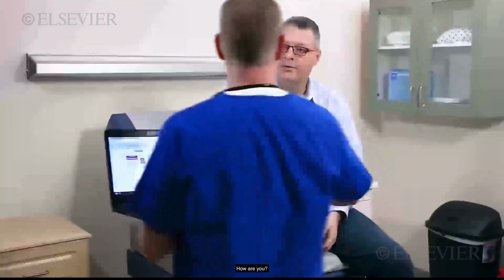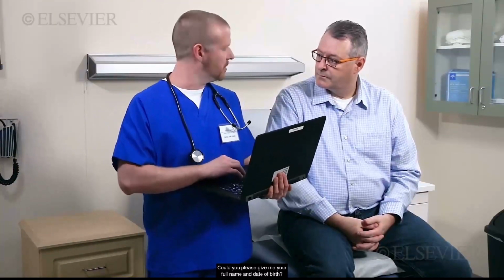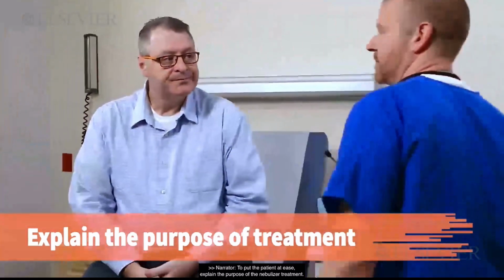How are you today? I'm good. How are you? I'm David. I am Dr. Jones's medical assistant. I'm just going to be working with you today. Could you please give me your full name and date of birth? Kevin Heron. To put the patient at ease, explain the purpose of the nebulizer treatment.